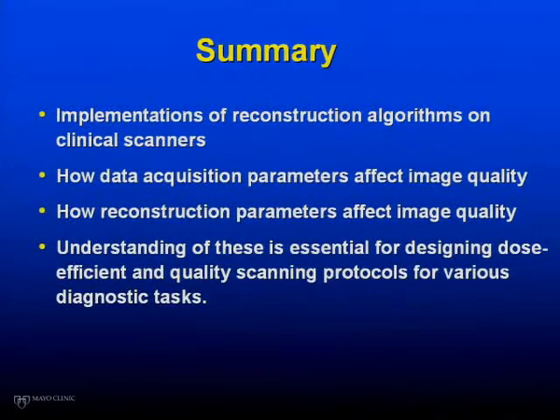It does not take into account the exact cone angle effect, and only by using exact reconstruction can the cone angle effect be removed. But iterative reconstruction can quantify the system geometry more accurately, and I can predict it can improve the cone beam artifact. Yeah, that's my guess.